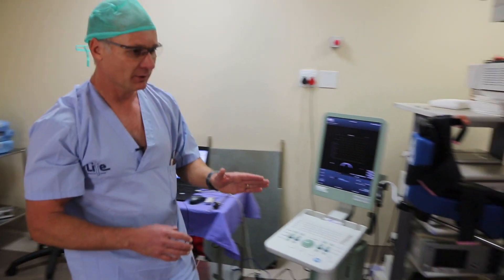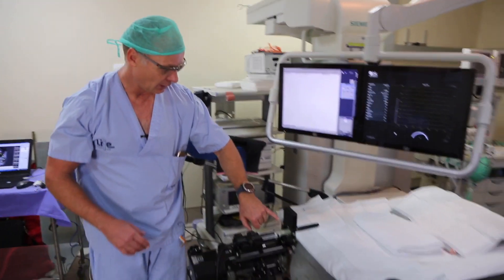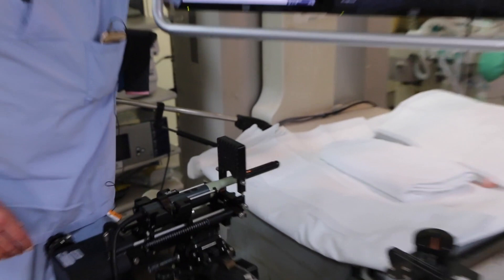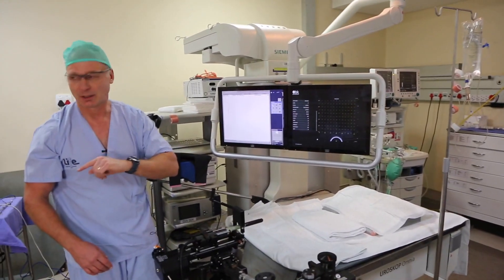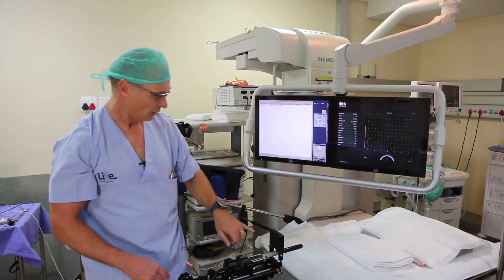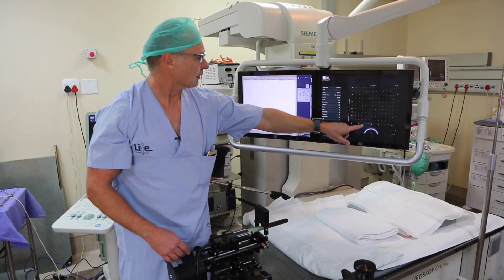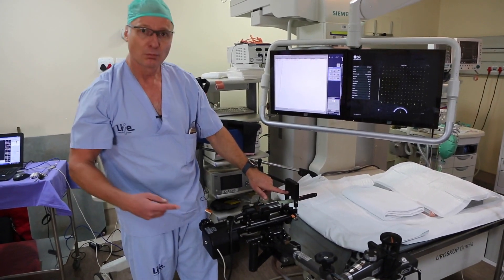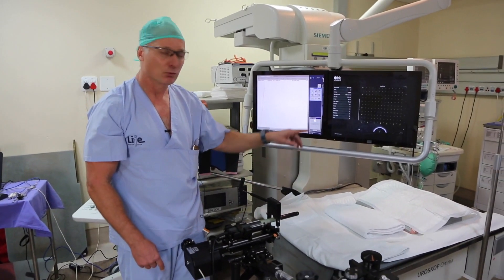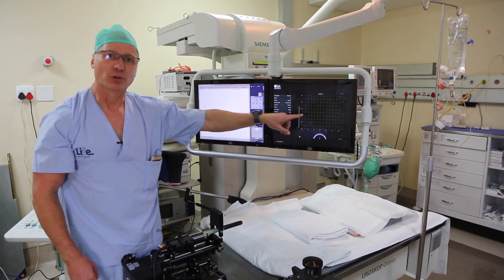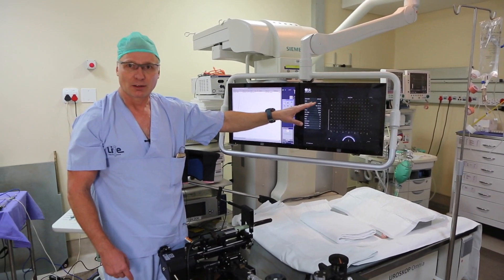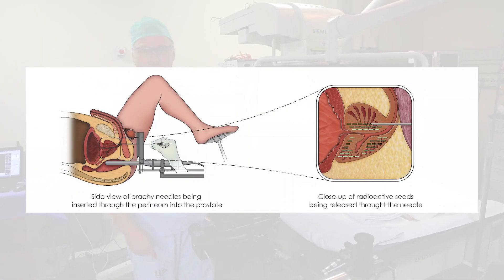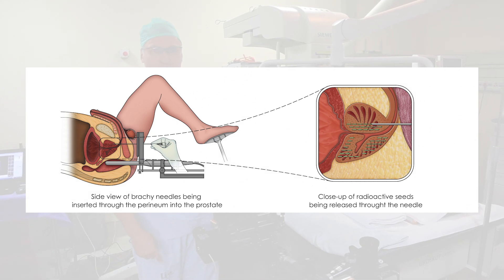So now we go back to the patient. You can see above the ultrasound is a grid. That grid correlates with the grid on the ultrasound and obviously the grid on the planning computer. If we know that we need a needle in C2, we can go through here at C2 and put the needle in. On the ultrasound we can see that it ends up in the right position — you can maneuver it a little bit to get it exactly in the right place. Then we put all the needles in. Typically 14 to 16 needles are used per session.